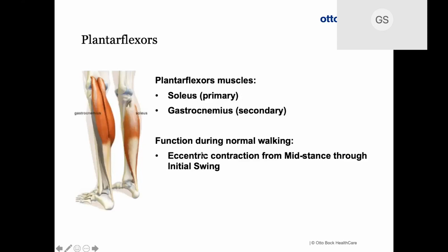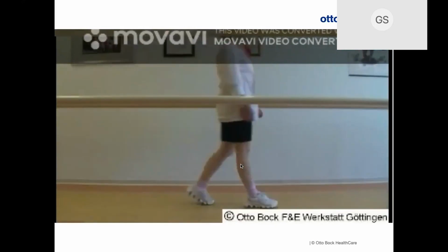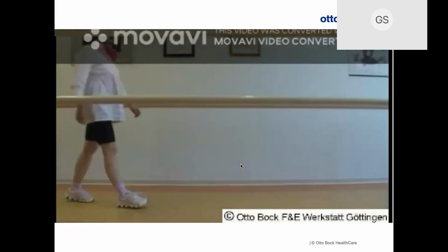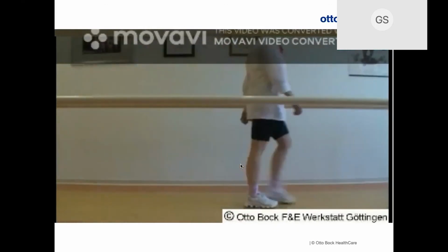So the big thing about the soleus is it's not a two-joint muscle. So this eccentric contraction from mid-stance to initial swing is so important to be able to lock out. Now here's the question: is the foot a cantilever beam or is the foot a mechanism? Again, it's a trick question because it's both. So it's sort of like a cantilever beam, but you don't necessarily have to build up as much deflection within the physiologic limb because you have your muscles being active.